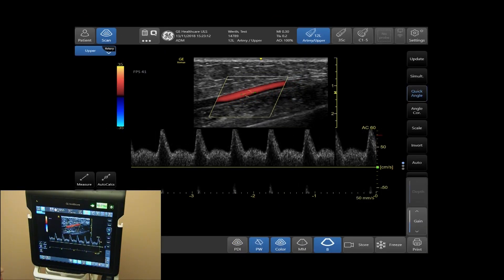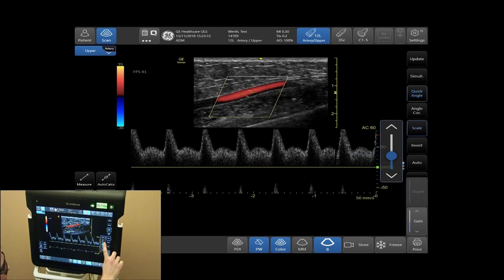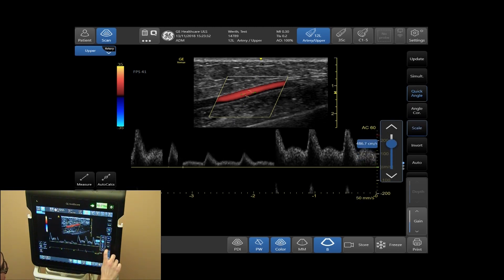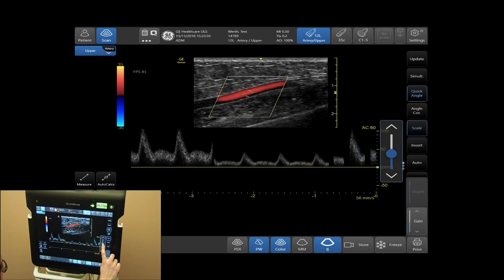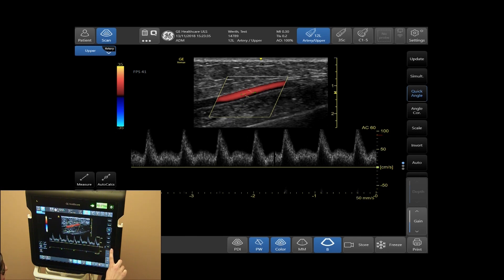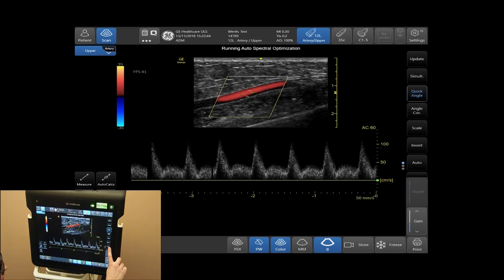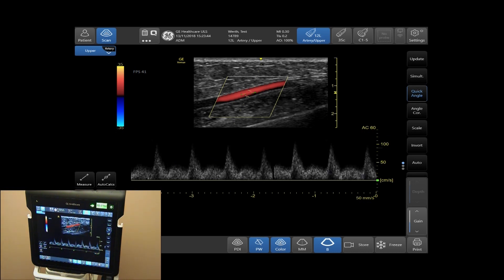To adjust your scale, tap on Scale in your sidebar menu. You can increase and decrease your scale. To adjust your scale and your baseline, if you select Auto, Auto Optimize will adjust your baseline and scale.